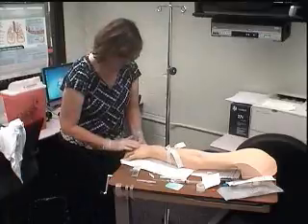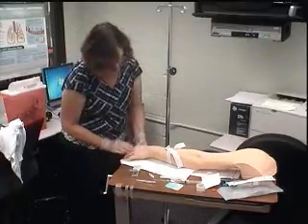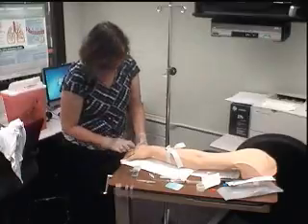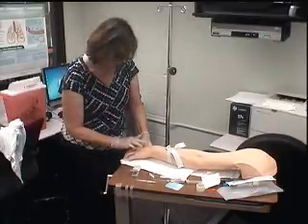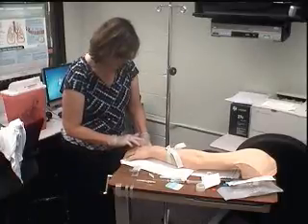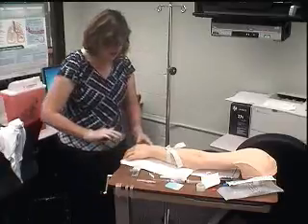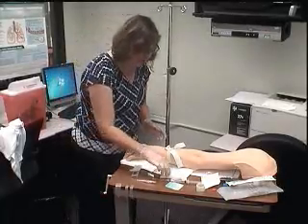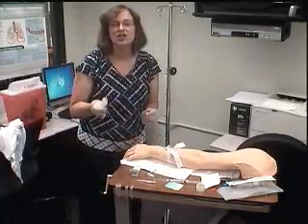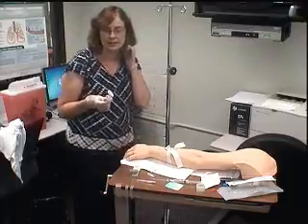I'm going to look at this and select my site, looking at the length of the site. Is that vein straight? Does it feel like it's got good blood supply? When I push down, does it kind of push back at me? You can feel it. And it looks like it's good. So now I'm going to clean it. Once I clean it, I can't touch it. So make sure you've got the area selected before you start to clean.